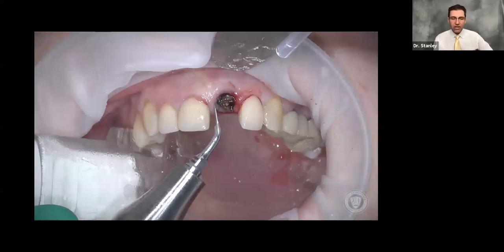This Cube product by Action — I've been using piezos for a number of years, and the main problem with piezos historically is that they don't have enough power; they take too long and aren't effective enough. But when it comes to aesthetic zone extractions, I've found no better tool than this Cube by Action. The Action product has more power than I need — I typically set it to 75% of max. We're going to go down on the mesial in a rocking action with this sword-looking piezotome, sinking it down to about the length of the root remnant, then do the same on the mesial and the palate.